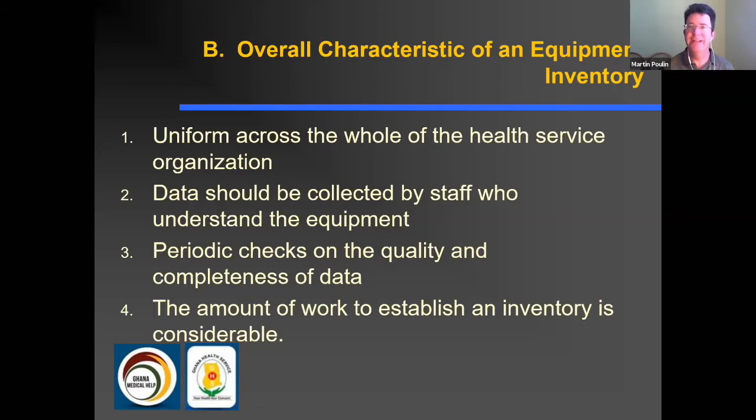Now it's important that this inventory data is collected by staff who actually understand the equipment. And so we're talking about technicians and clinical engineers who understand what a device is called, what family it is, what is the subcategory or specific name of the device, so that you can enter the inventory consistently. You also have an opportunity to do periodic checks on the quality and the completeness of the data in the inventory to ensure that it maintains its accuracy.